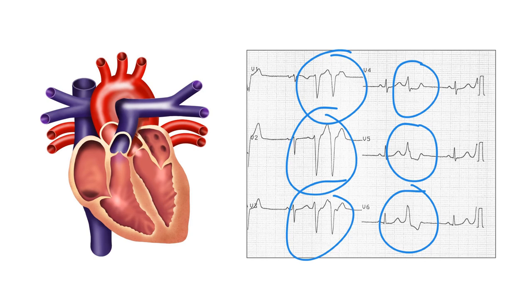If a ventricular ectopic beat arises in the right ventricle, then it will activate the right ventricle first before activating the left ventricle. This is a pattern of depolarisation that we see in left bundle branch block. So when a ventricular ectopic beat arises from the right ventricle, it will have a left bundle branch block morphology. Conversely, ventricular ectopic beats arising in the left ventricle will have a right bundle branch block morphology on the same principle. Looking at this ECG, the ventricular ectopic beats have a left bundle branch block morphology, meaning these ventricular ectopics are arising in the right ventricle.